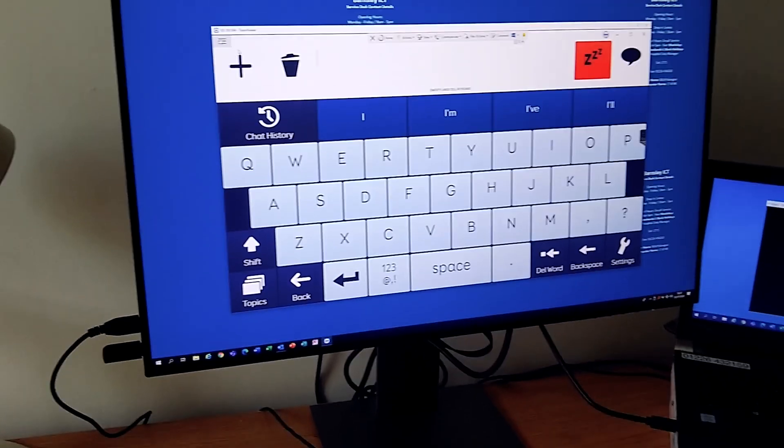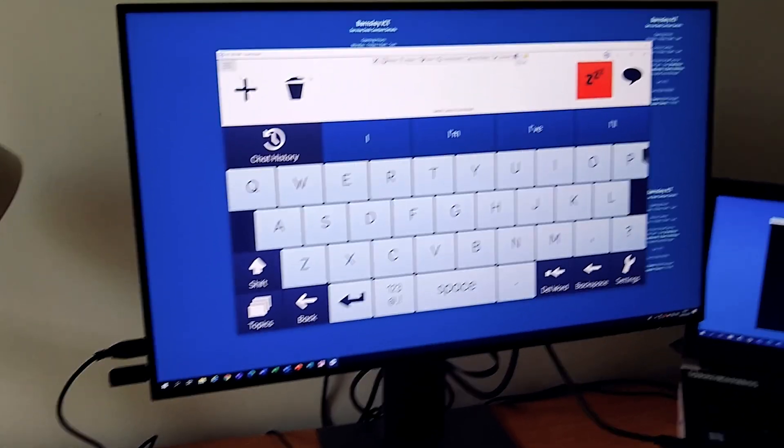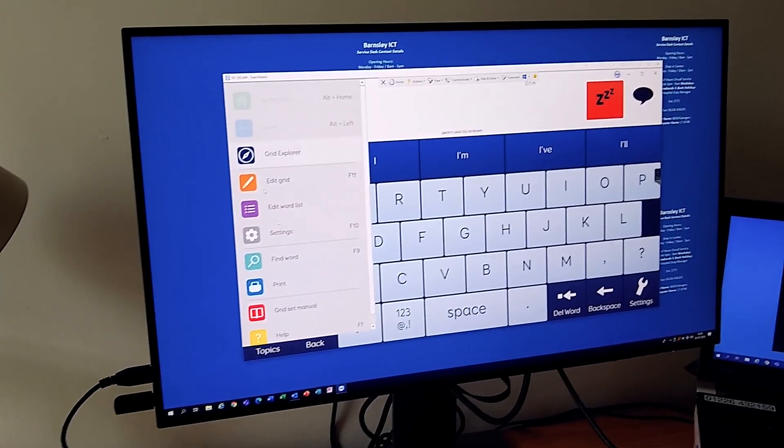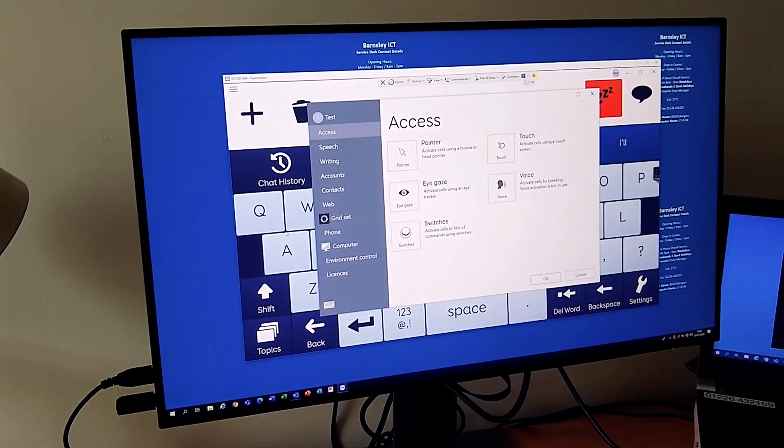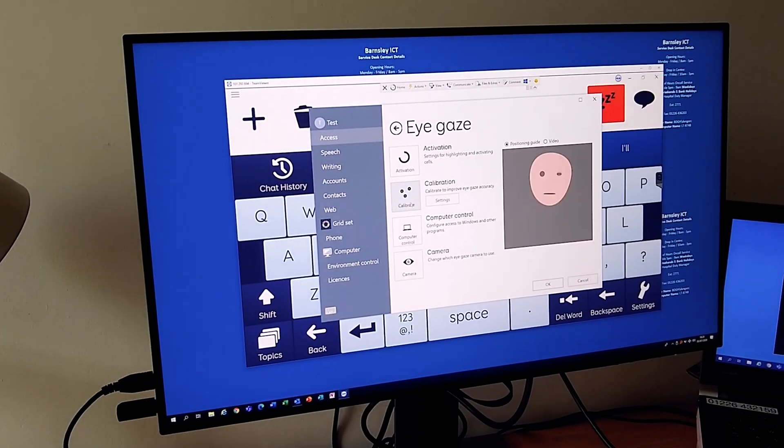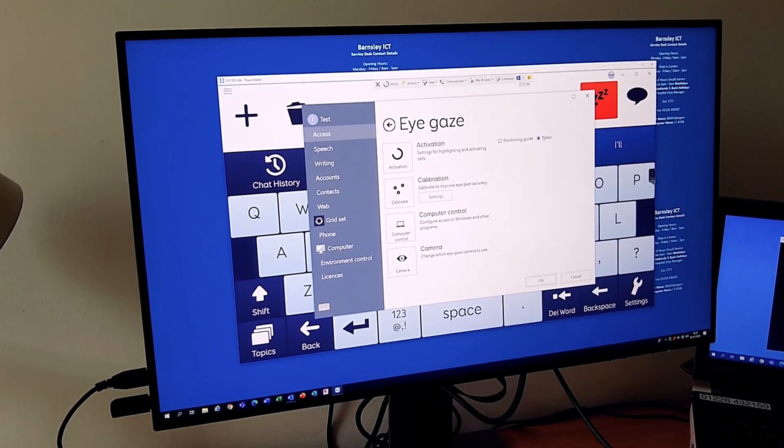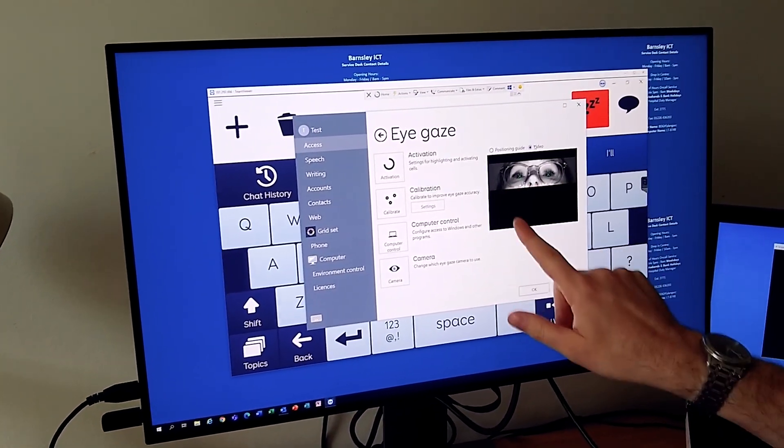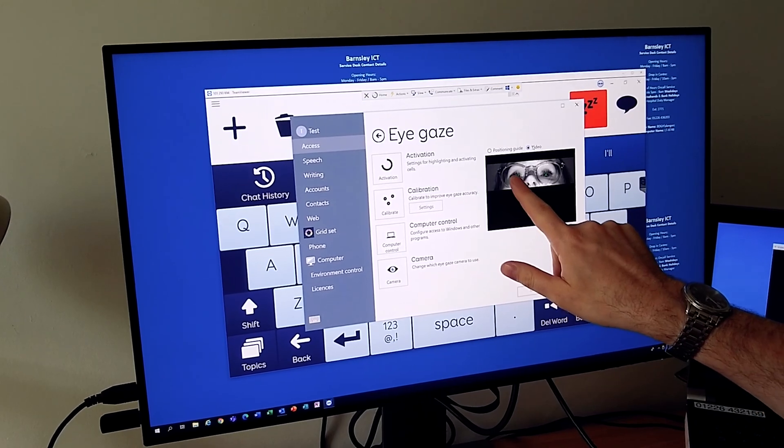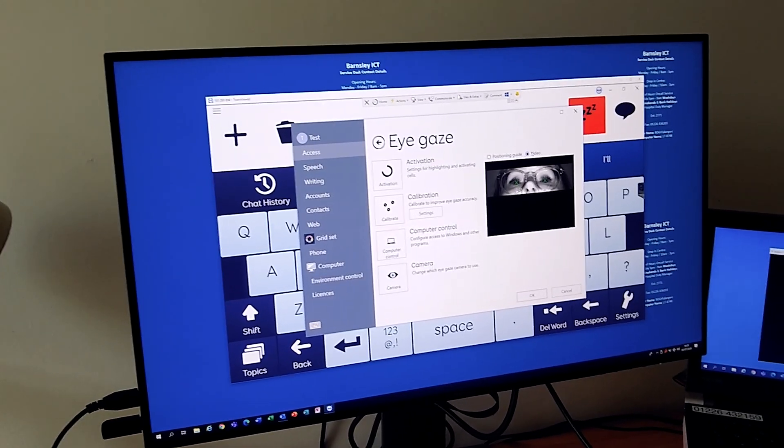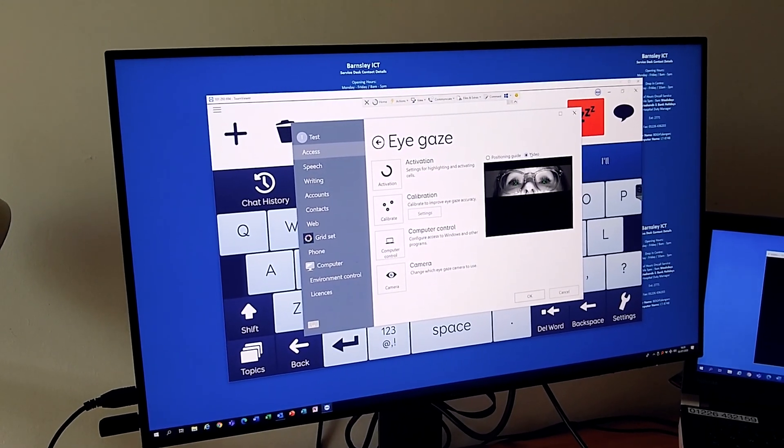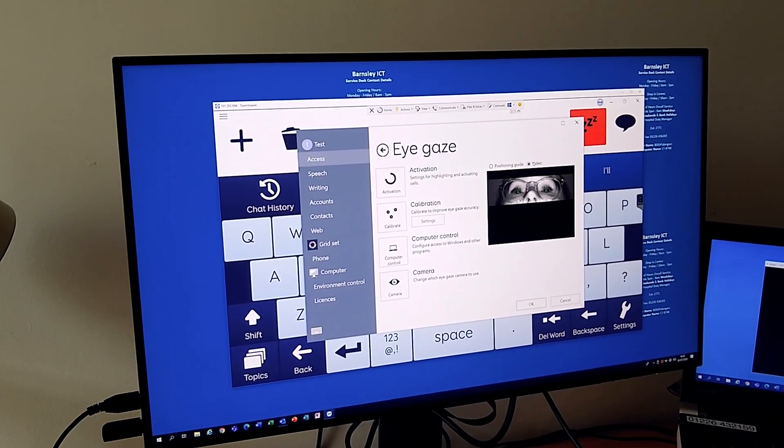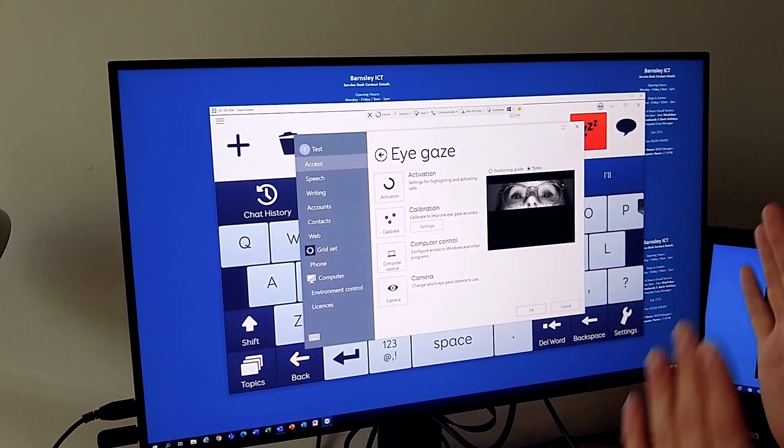This box here is an image of her screen on her own computer using TeamViewer. The software I'm running is the Grid 3, and if I go to the eye gaze here I can see a video of her. I can see her eyes, so I can have a good look at her eyes to make sure they're going to be suitable for eye gaze.